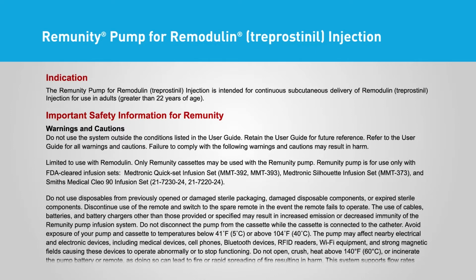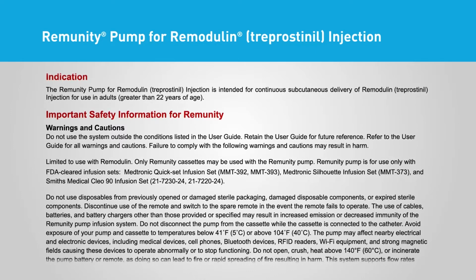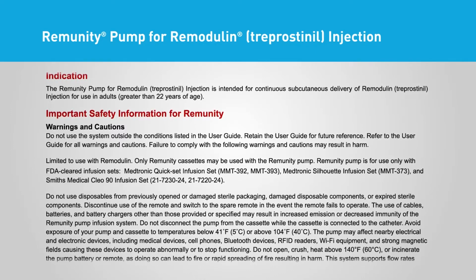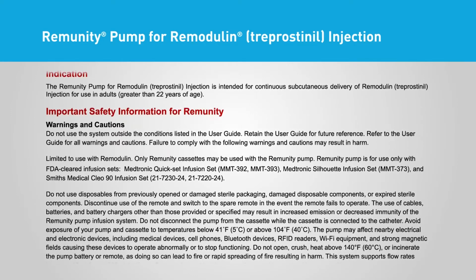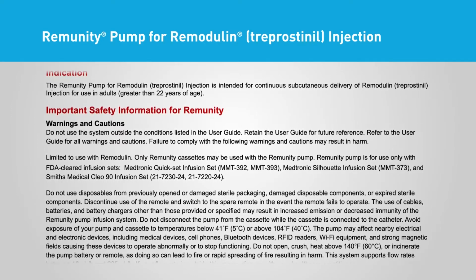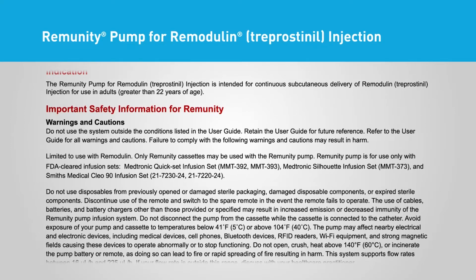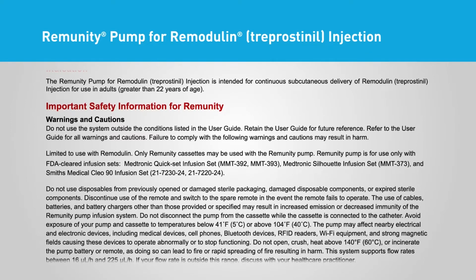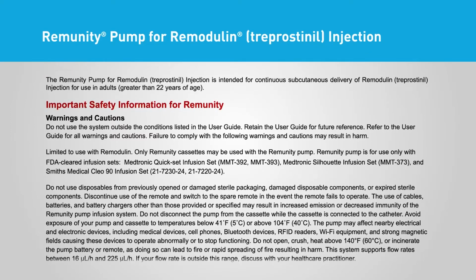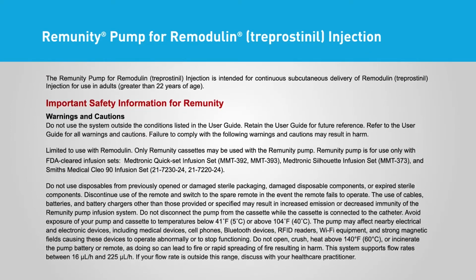Warnings and cautions. Do not use the system outside the conditions listed in the user guide. Retain the user guide for future reference. Refer to the user guide for all warnings and cautions. Failure to comply with the following warnings and cautions may result in harm. Limited to use with Remodulin. Only Remunity cassettes may be used with the Remunity Pump. Remunity Pump is for use only with FDA-cleared infusion sets.